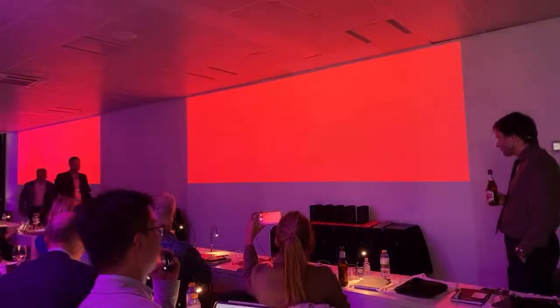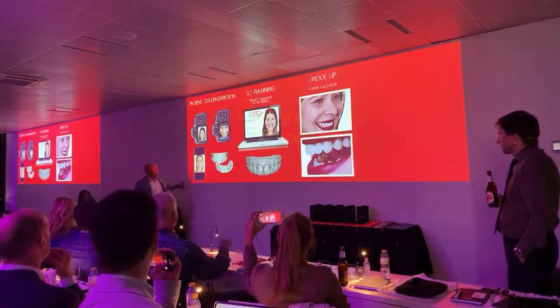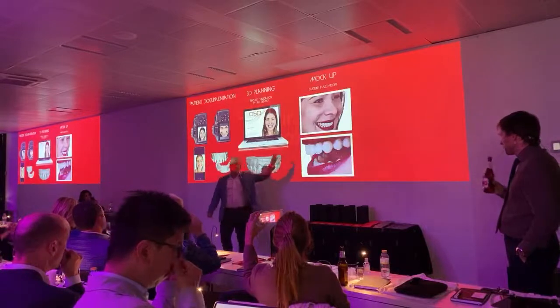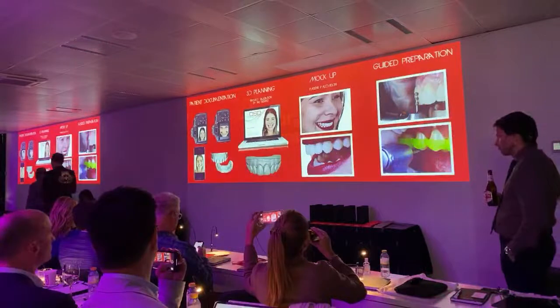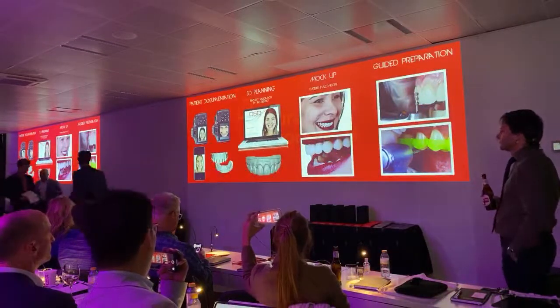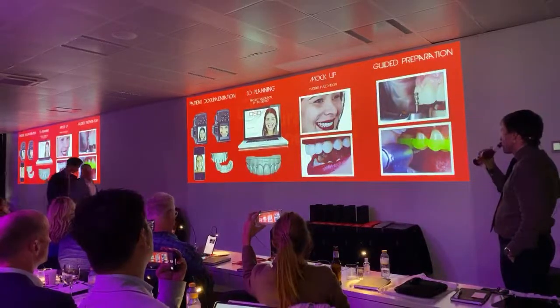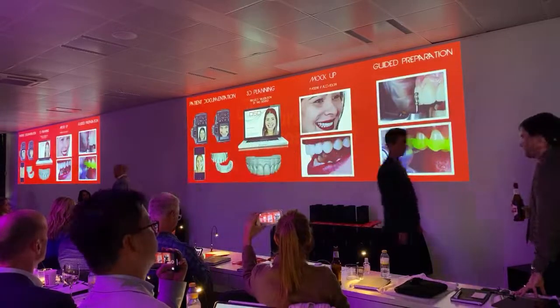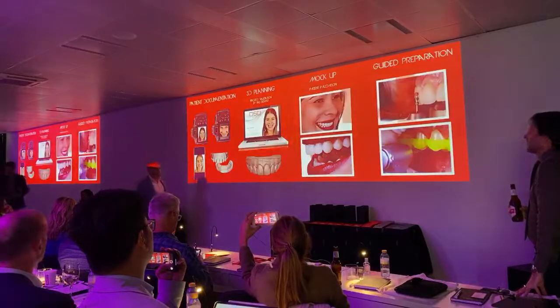So, let's go. Just to remind you, of course, you know all of this, the patient documentation, 3D planning, and patient validation with the model, right? So after that, we need to start with guided preparation. It's very important to keep the same design since the beginning. And this way we can deliver the final restoration exactly like we planned it with our design. Right? I will talk a little.